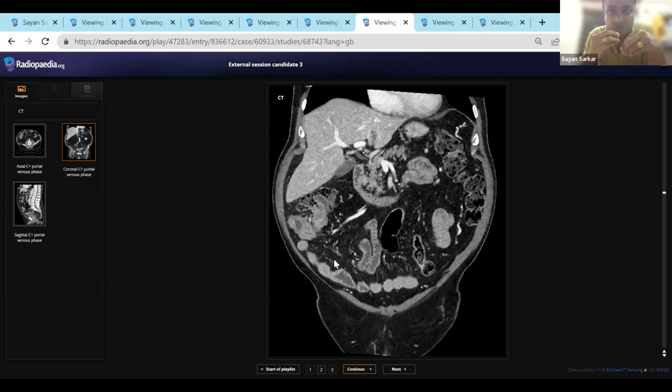No, what I'm trying to say is, what is the lead point? I mean, malignancy is obviously there, but are there any other lesions that can be a lead point as well? Metastasis? Yeah, other than neoplasia. I mean, see, everything is neoplasia. What I'm trying to say is, any particular lesion or any kind of entity that you can think of?